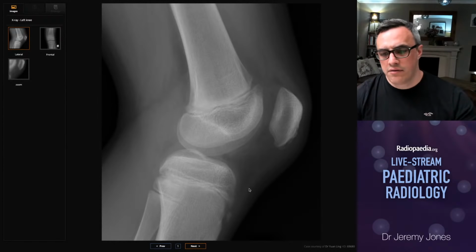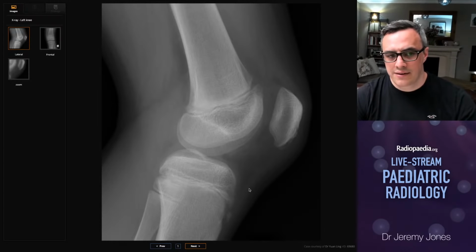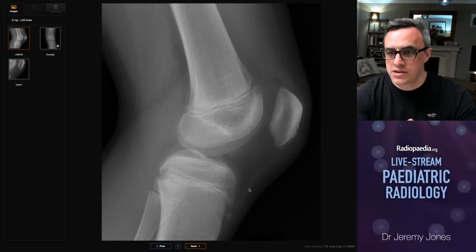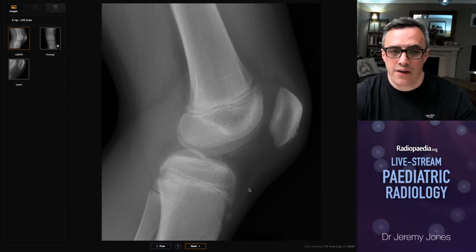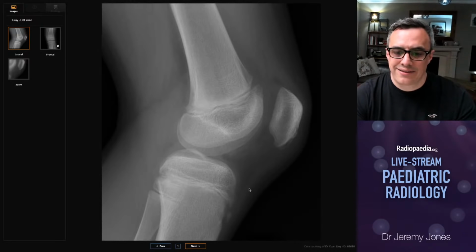And then the other end of the patellar tendon, we get the situation with the patellar avulsion versus Sinding-Larsen. The problem here is that the imaging findings are very similar. So you've got to rely a little bit on your clinicians and the story from the patient. So actually, this is one of the situations where ultrasound's really great, because you can ask them. You can ask them how long it's been sore, what they do, how active they are, what sports they like. Are they a basketball player? Do they like jumping sports? Are they active in that?